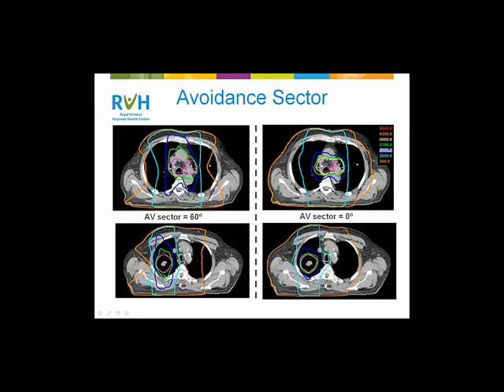How long is the treatment time with a hybrid plan? Typically, the patient treatment slot is 15 minutes. Once they're aligned and cone beamed, it's around 4 or 5 minutes of beam time. Actually, probably even less than that. Somewhere between 3 and 5 minutes.